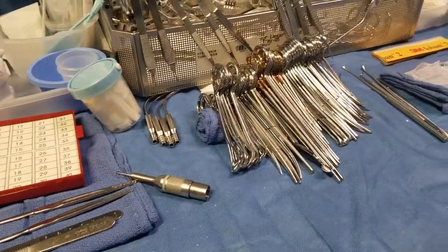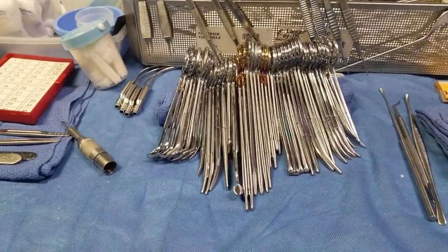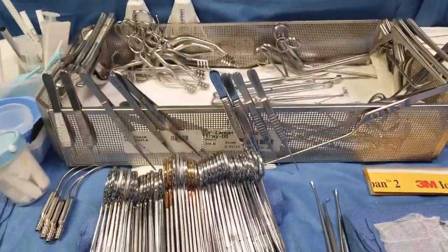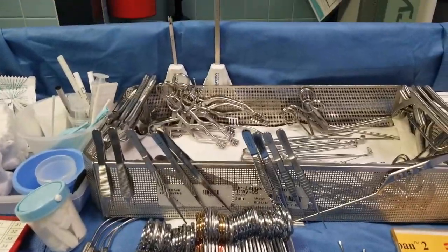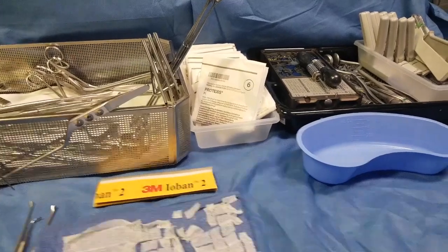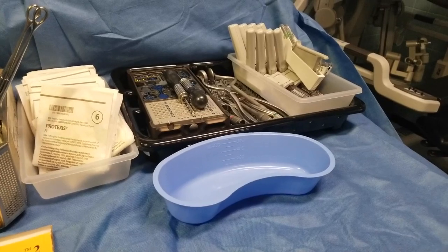My roll is firm and thick so that my instruments do not flop over. All my instruments are inside it, along with any accessories needed. I have my gloves organized in order in a bin, and in the back I have my plating system.